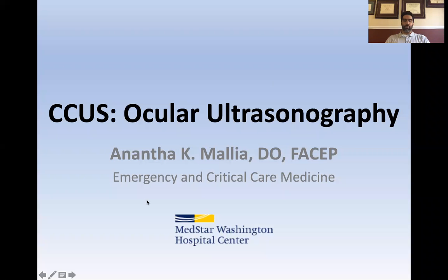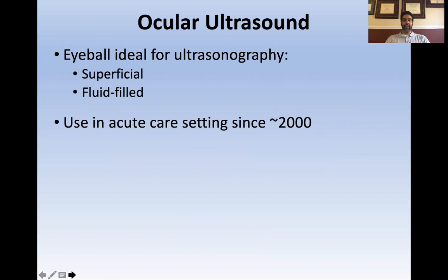Let's talk about the eyeball, ocular ultrasonography. If you think about it, it's almost like the eyeball was created for being ultrasounded. Because if you look at the structure, it's superficial, it's right at the surface, and it's fluid filled, which makes it really amenable to imaging using ultrasound.